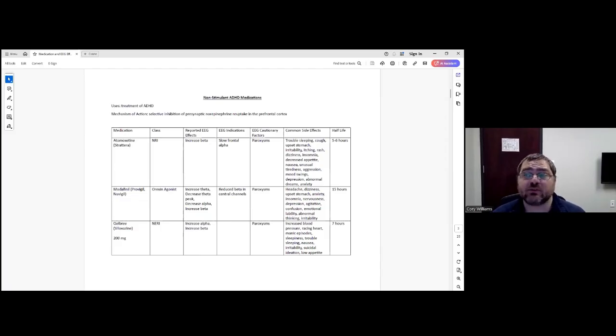And sometimes we have done EEGs for people where they want a med washout, so that they can see what their brain looks like without meds. And so we might tell them, hey, we had you scheduled Monday, but that's not within the washout period. So come back next week and then we'll get you in. But that's if that's the specific goal. The half-life is, what that means is how long does it take for the medication to be present by half.